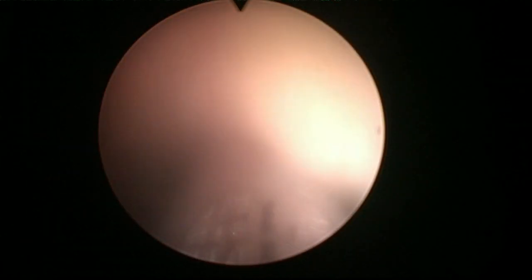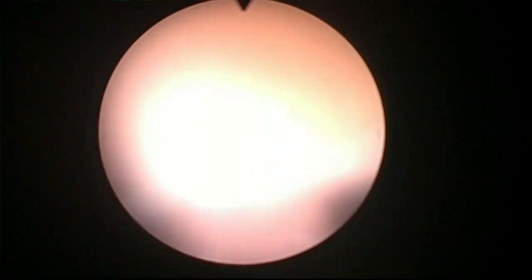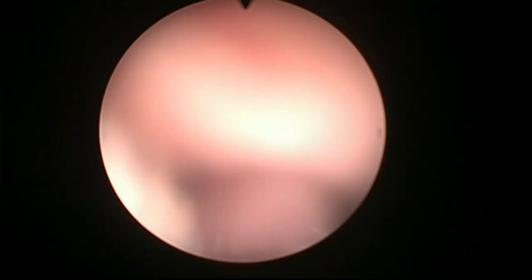If you cannot see the mouth of the morcellator, like now, we only see tissue in contact with it. There will be very little water coming out and a lot of tissue. If we can see the mouth a lot, it means that you're sucking out a lot of water. Then you have to be careful because the bladder could empty and the bladder wall comes closer to the morcellation blades. I have had accidents in the past, but luckily they were not terrible, and they could be managed conservatively.